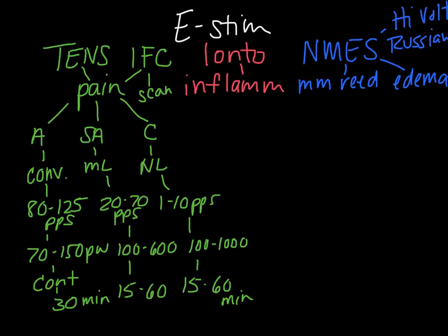Because of that high carrier frequency, IFC can be more comfortable. It does allow you to provide the electrical stimulation in a larger area and sweep it over an area. So there are some considerations of why you might use one over the other, but in the end, TENS and IFC are for the same purpose and work via the same mechanism of controlling pain.